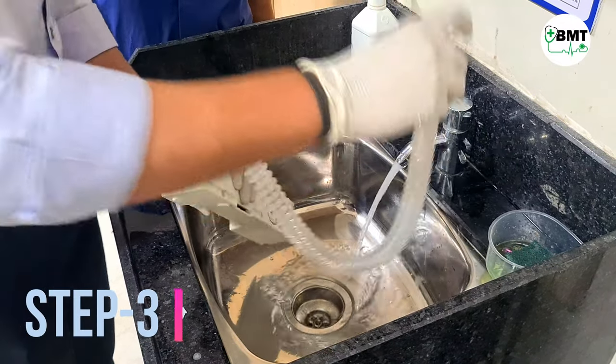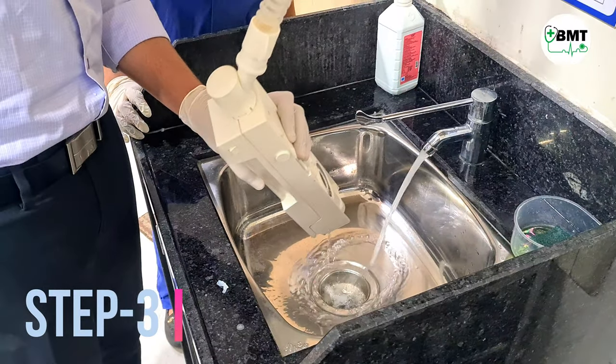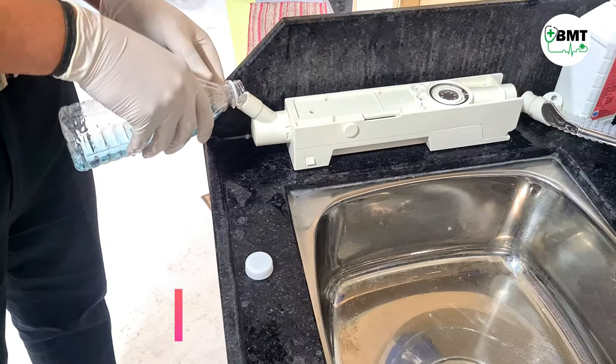Step 3. Rinse the cassette by making water pass through it 2-3 times.